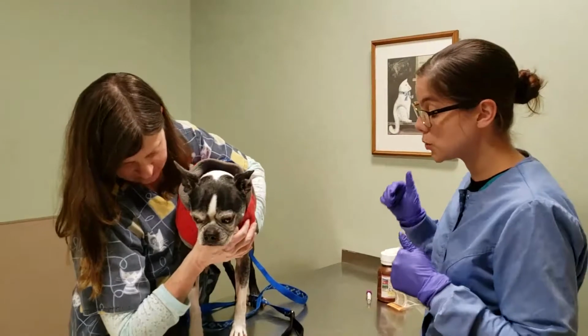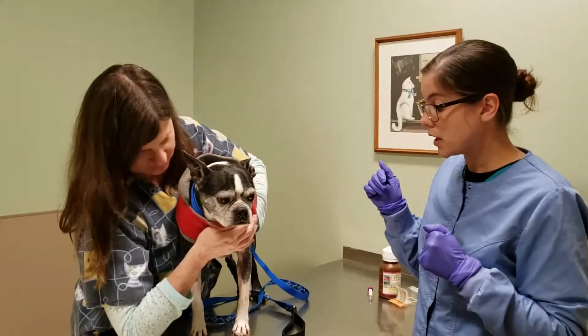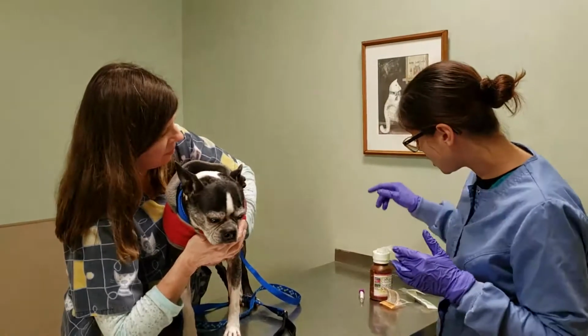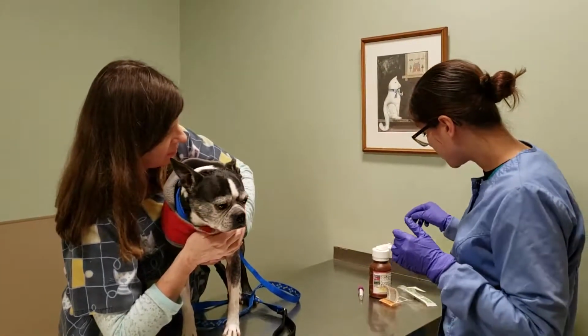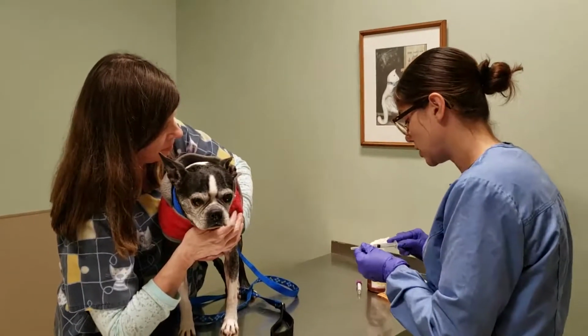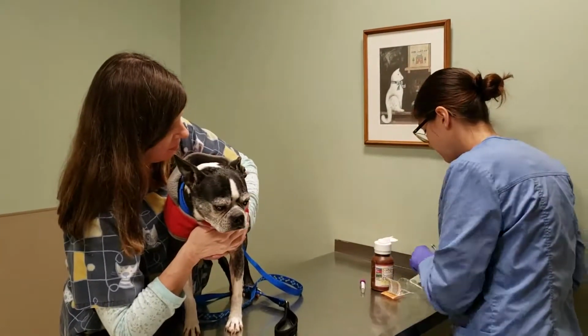Okay, so for this procedure, we're doing a cross match. We're getting blood from our donor. So we've got our alcohol swab, our purple top tube, and we're going to use a butterfly because he's just a little guy.